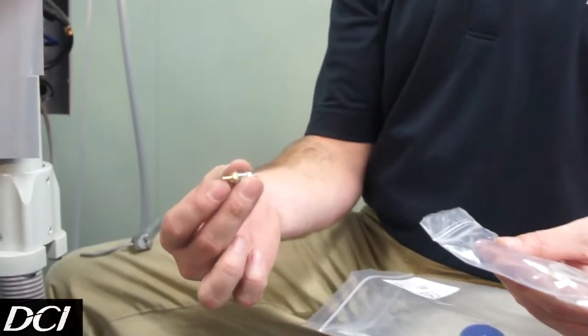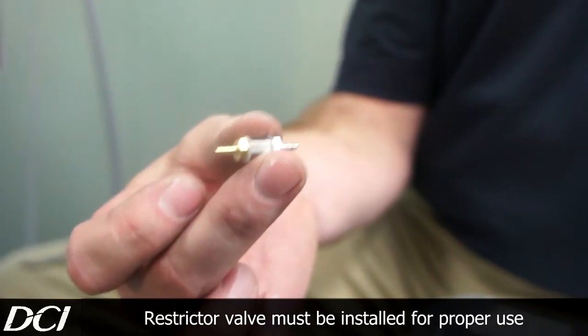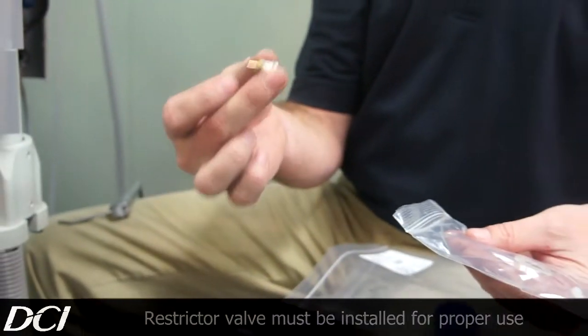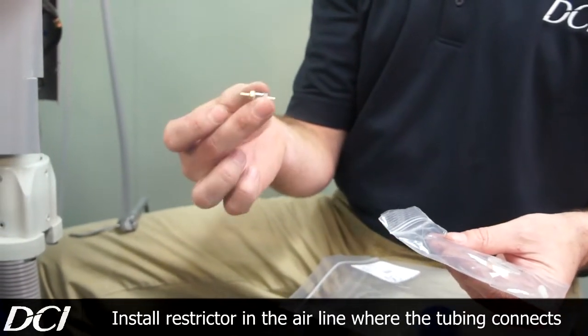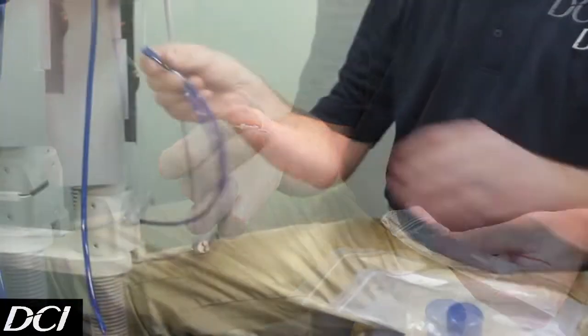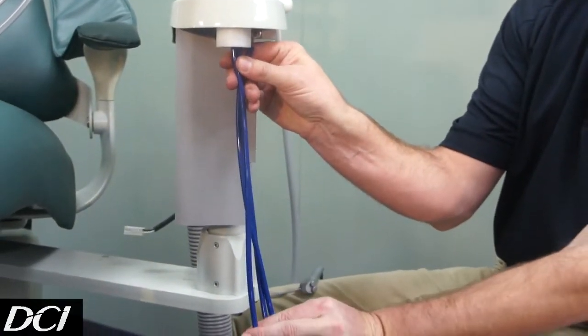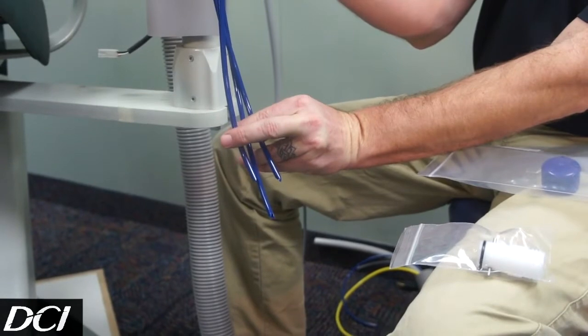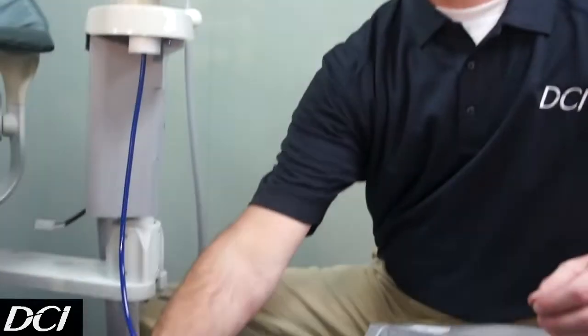The kit also includes a restrictor valve. This restrictor is going to be placed on the air line going into the bottle — we're not going to show that in this video to keep it quick and brief, but it needs to go in-line on the air line going to the top of the bottle. The importance of the new tubings is that they're just a little bit longer than what came factory. You can see that one is just a little bit longer and it's going to reach to the bottom of the bottle the way we need it to.